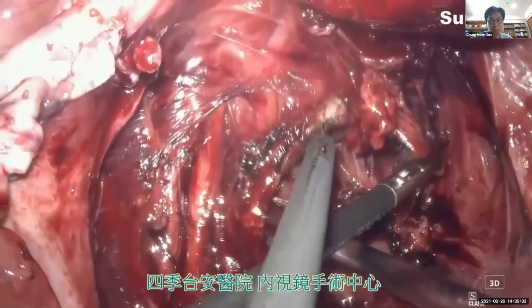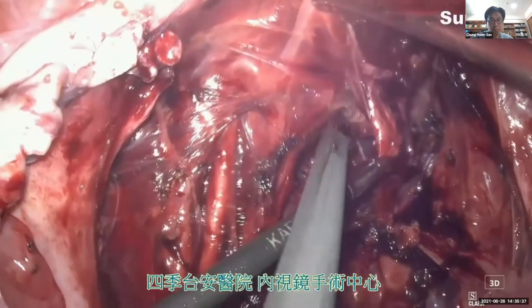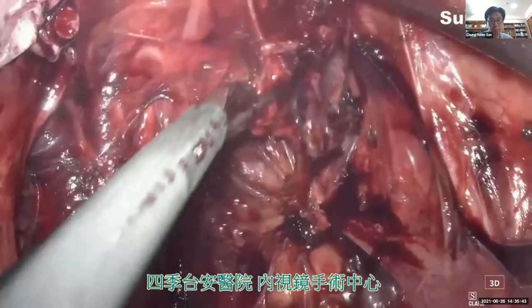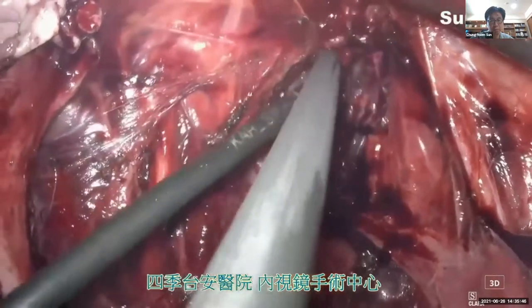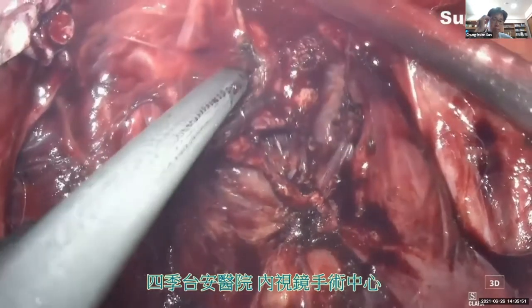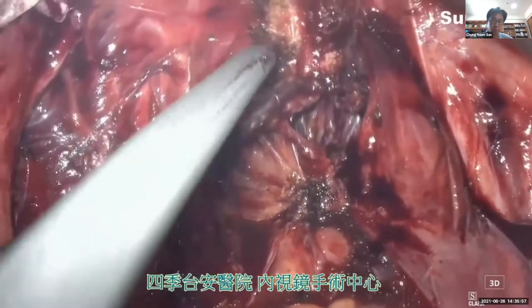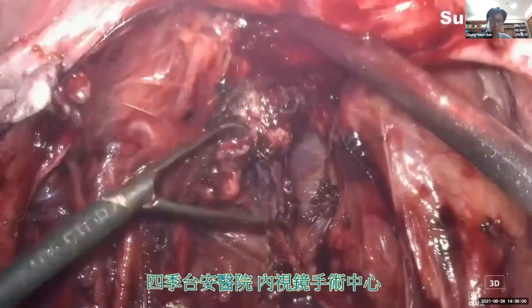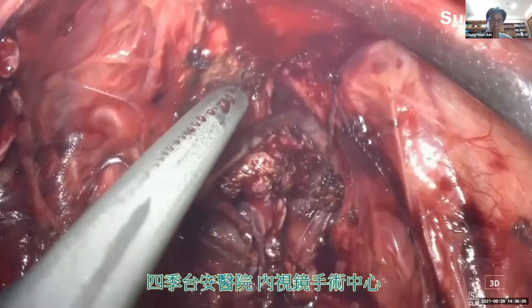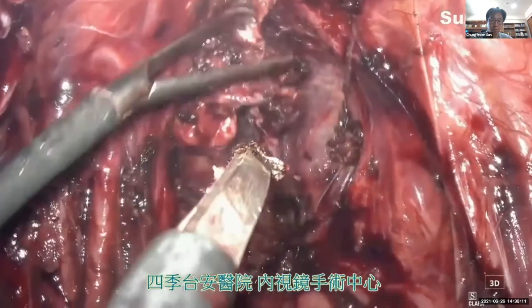Now we are approaching the retrocervix area and the torus uterinus area again, from the left side. Now we are going to excise the torus uterinus and the retrocervix DIE lesions along with the uterosacral ligament lesions.